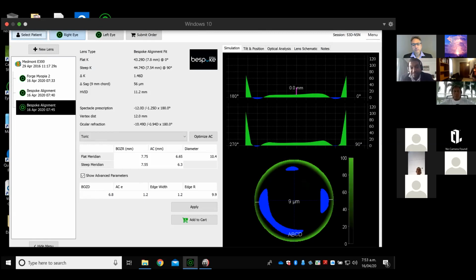Would you agree? In New Zealand, we obviously have a health board subsidy. Our national government has a health board, and if you are over a certain prescription or have a particular corneal condition, they will subsidise the cost of these types of specialty lenses for the patient, because glasses simply aren't the most appropriate form of correction. That also includes anisometropes and aniseikonics, as well as high ametropia.